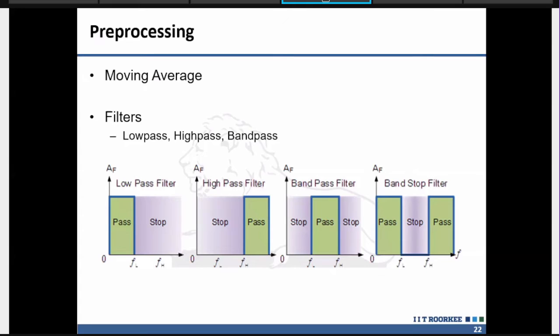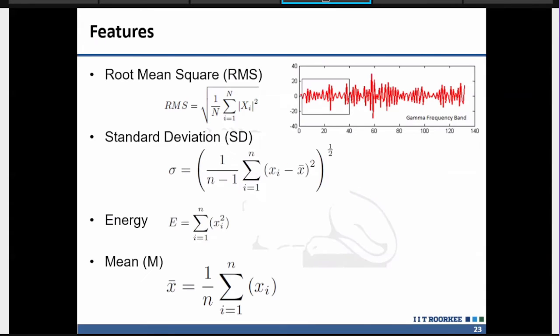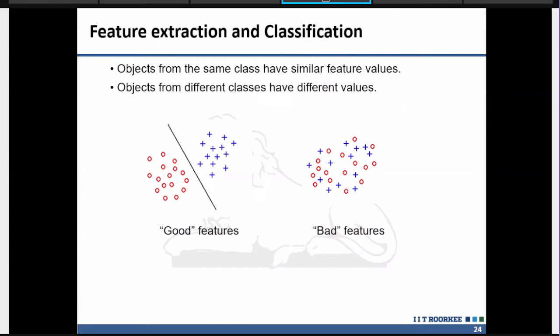So we have these EEG signals, and they could have some noise, so we need to remove that noise. We can remove it with noise removal algorithms, like filters, and after that we use some feature extraction. Why? Because we want to do classification, right? For example, in a machine learning problem, we will have data which tells whether it is from the positive or negative side.